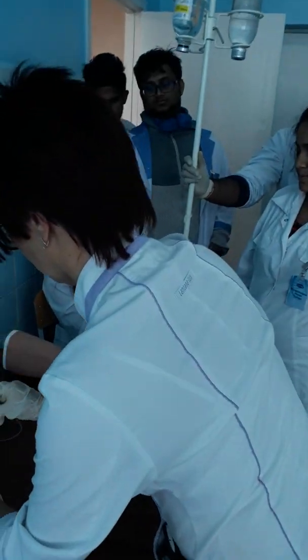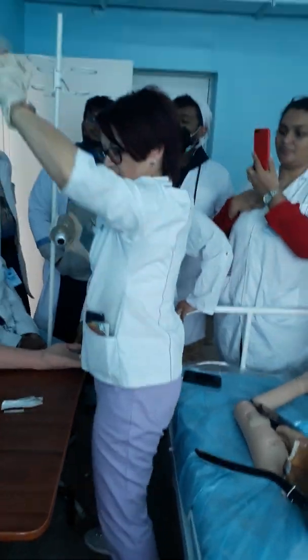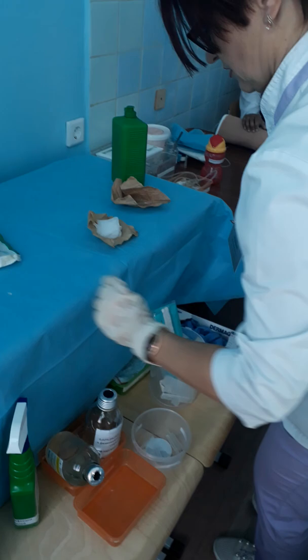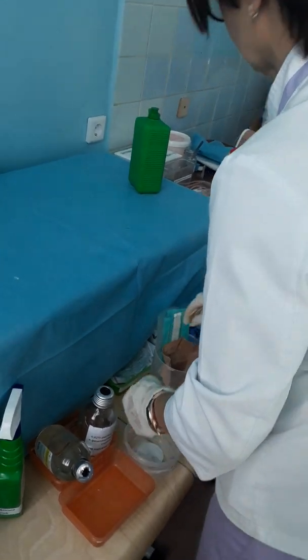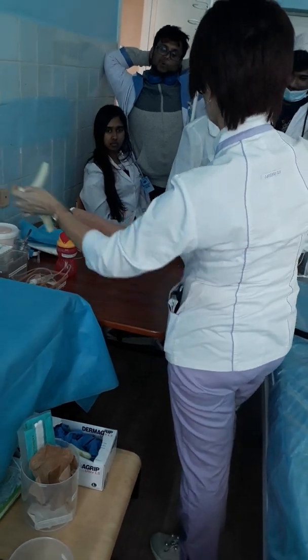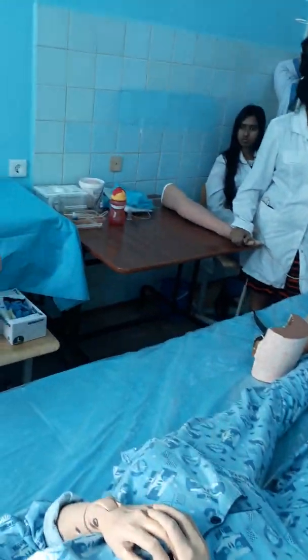This needle you can remove without your hand and place in the container for sharp items. This is a special container, and the other items you utilize like this. And after that, clean your table, remove and utilize your gloves, re-clean your hands and check the information about the patient and what you are doing with medicine.